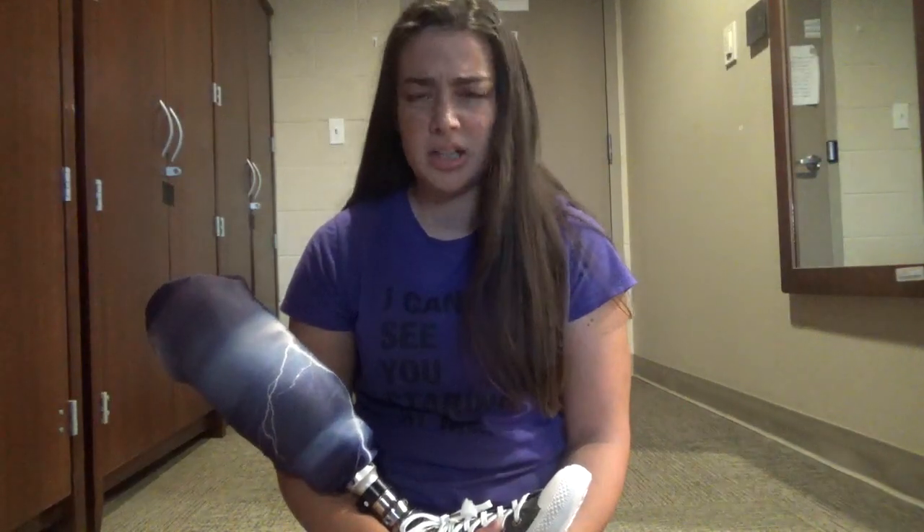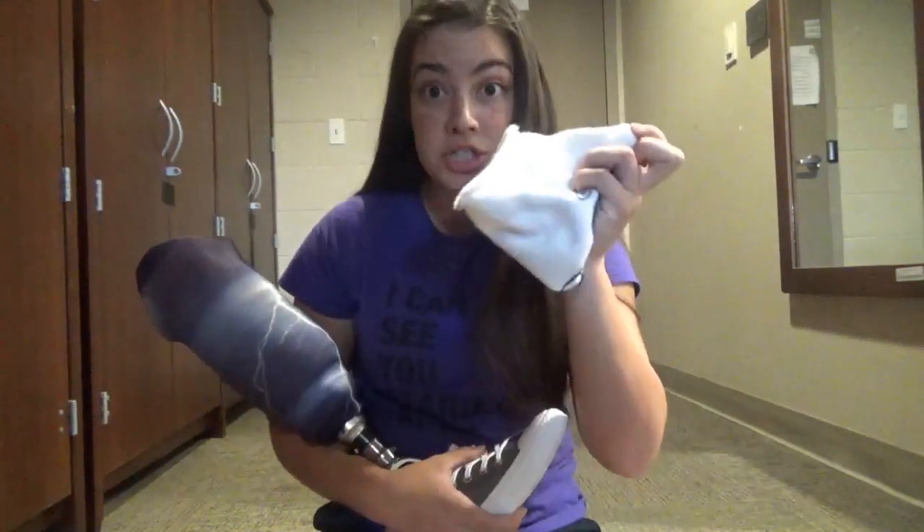When you have a socket made, it is cast to your leg. However, in the first couple months after amputation, your leg will shrink and swell a ton. Your options when your leg shrinks that much are to make a new socket every time, which is time-consuming and expensive, or use stump socks.